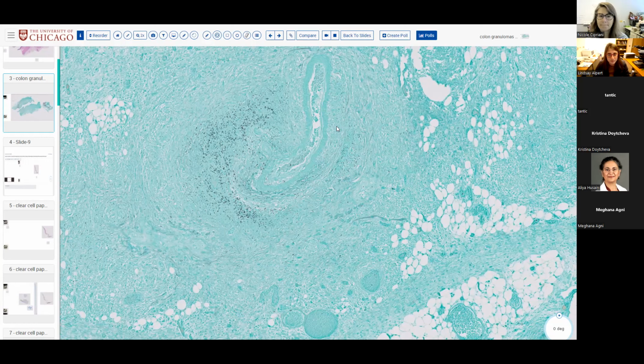Yeah. So was the mucosa involved also? I mean, could this have been diagnosed on a biopsy? So it was very ulcerated. There weren't really aggregates of histiocytes in the mucosa anywhere. It was always in these very ulcerated areas. So I doubt it could have been diagnosed on the biopsy unless you were lucky and they biopsied an ulcer and it happened to be there, but it would have been very hard to diagnose on the biopsies. Yeah, the area that looked like ulcerative colitis didn't really have these changes in it. Okay.